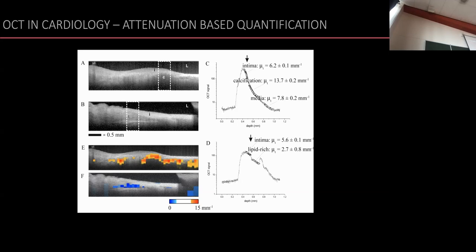I don't fully know anymore what it was because I'm out of cardiology for a while now, but it had clinical implication treatment. And based on work developed by Dirk before, we were able to look at what we call the attenuation coefficient. You guys still remember what it is? Has been explained?